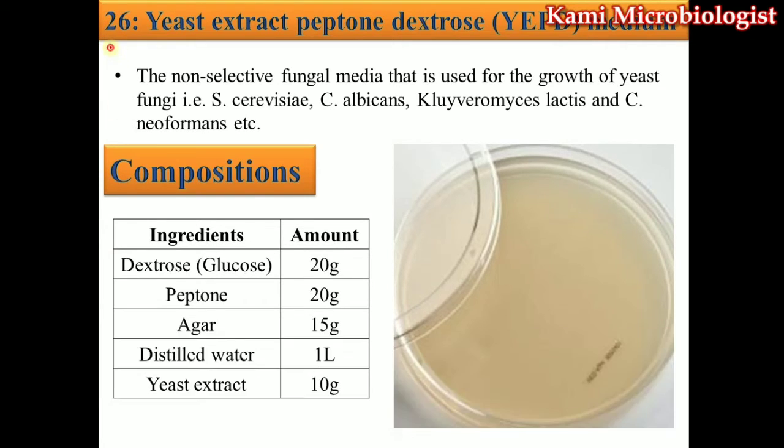Today in this video lecture we are going to talk about yeast extract peptone dextrose medium. We also call it YEPD medium. It is a fungal culture medium which we specially use for the growth of yeast fungi like Saccharomyces cerevisiae, Candida albicans, Kluyveromyces lactis and Cryptococcus neoformans, etc.